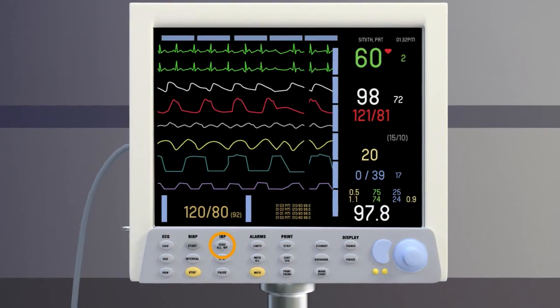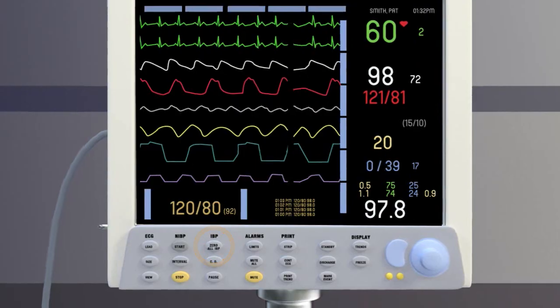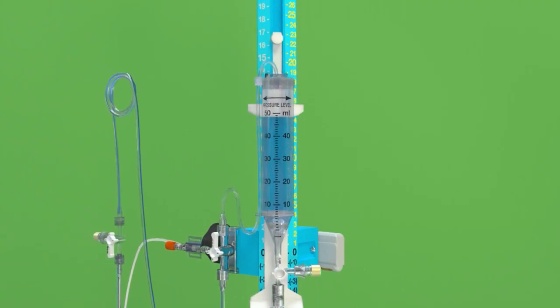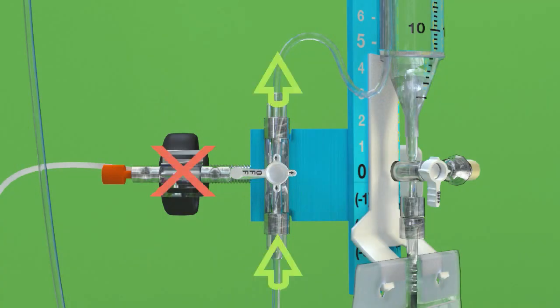Push the zero button on the bedside monitor and the transducer is now zeroed to atmospheric pressure. Once the pressure transducer has been zeroed, raise the drip chamber back to the prescribed setting. Finally, adjust the main system stopcock so it is turned off to the transducer, thus allowing fluid flow from the patient into the drip chamber.